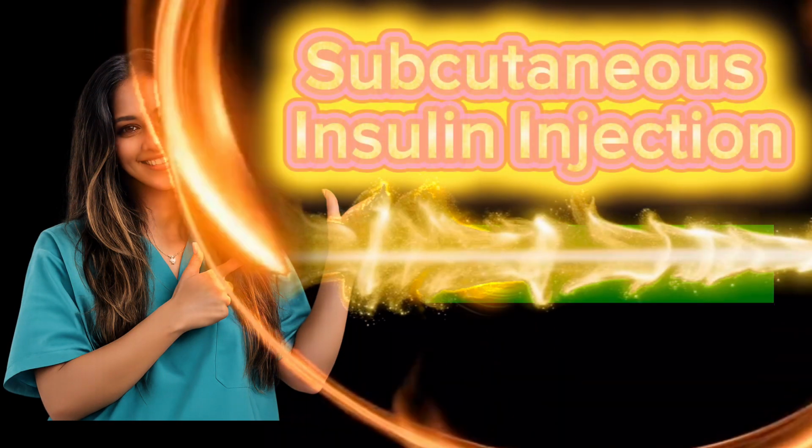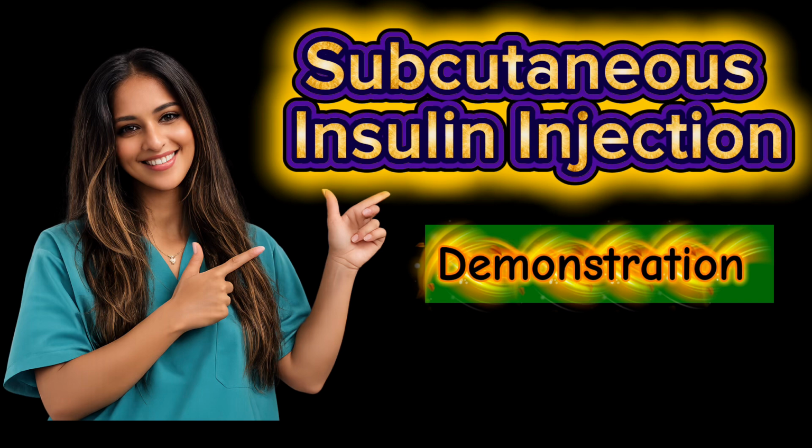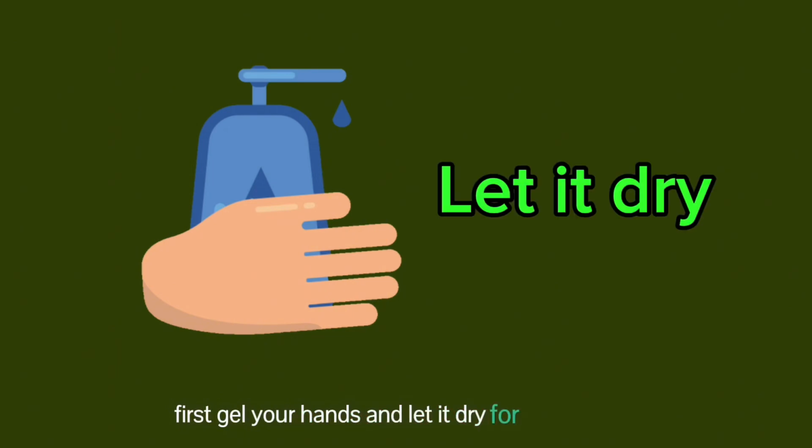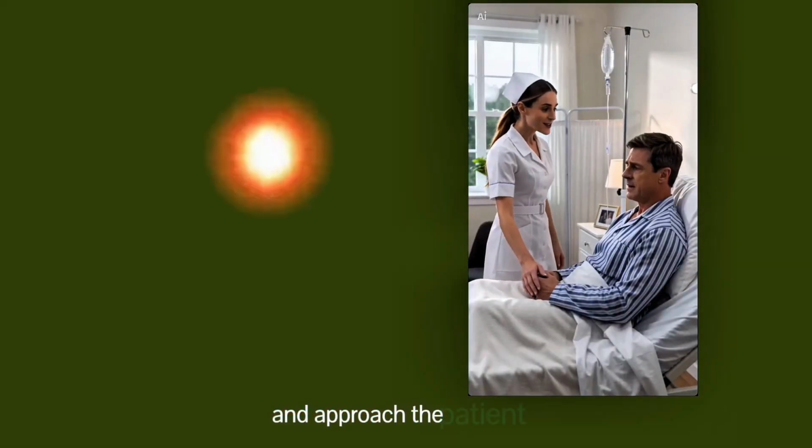Today I am going to talk about subcutaneous injection demonstration. Now let's start the procedure. You will be given a scenario first. First, gel your hands and let it dry for 30 seconds and approach the patient.